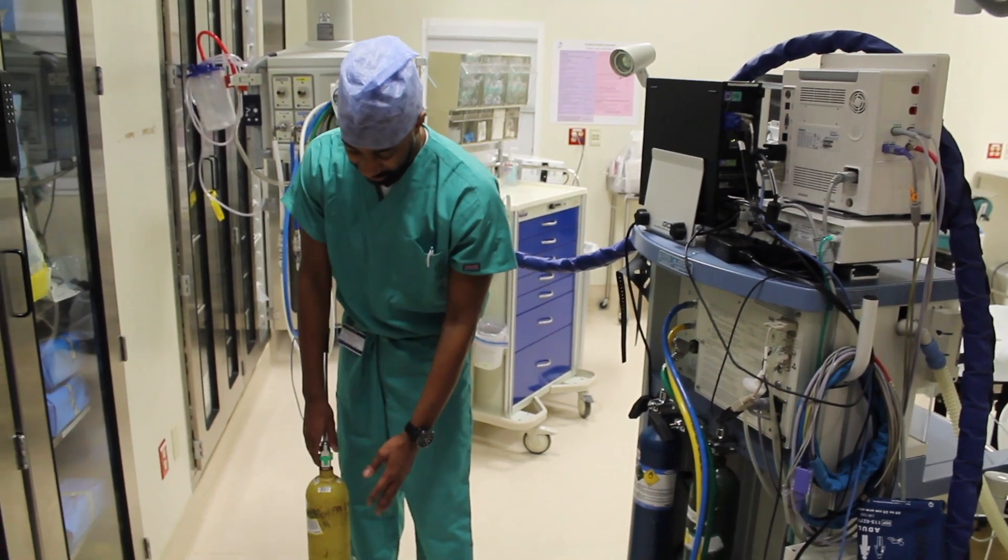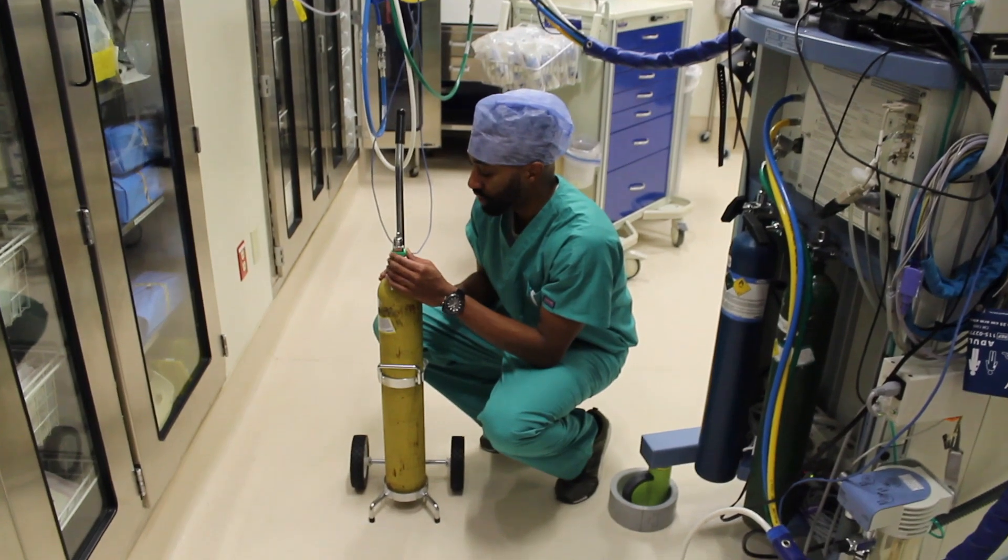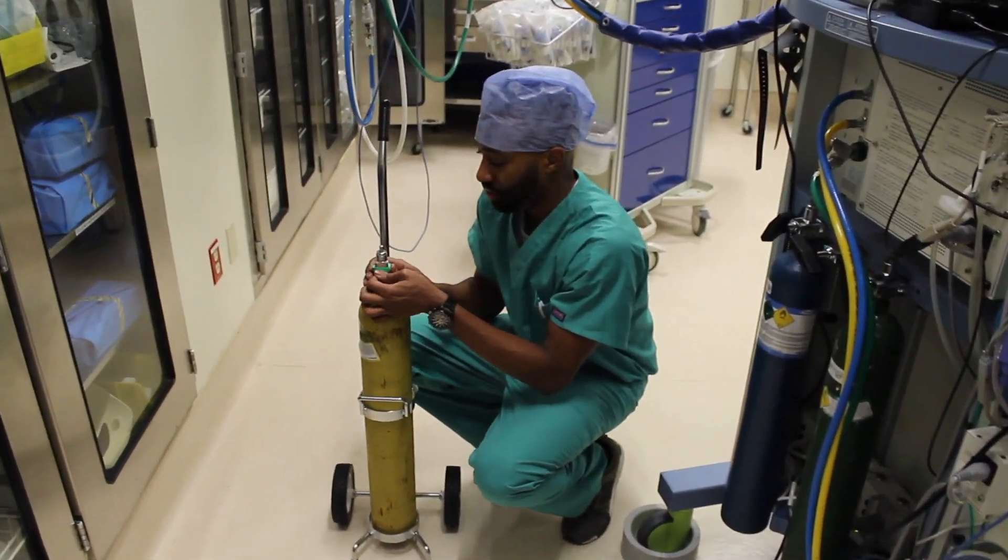All right, let's change the air cylinder. First thing you have to do: make sure this is closed, sealed, is not broken. Everything should be here and still secure.